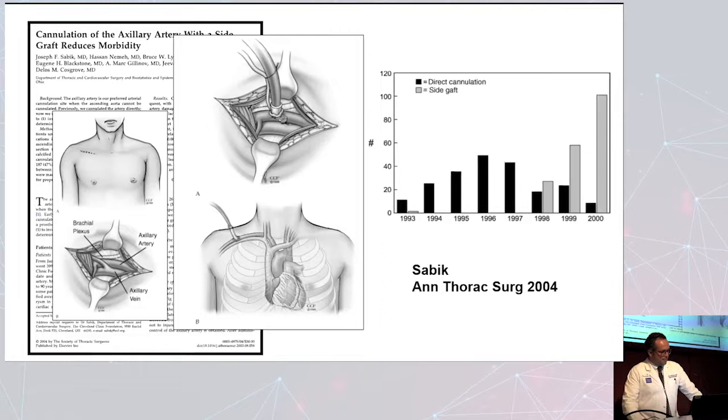Here, the important thing is that somebody asked me one time, "Did you just put a cannula directly into the axillary?" Well, they did it before, and they had a lot of problems with access, problems with dissections and neurovascular complications. So that's why the group at Cleveland Clinic, specifically Dr. Svensson, popularized sewing a graft. And since 1998, I think everybody uses some sort of graft. Is this 8 to 10 millimeters? We tried to make you happy, because you see an 8 in a big patient and the line pressure is 300 and everybody gets alarmed. I think I'm happy with that.